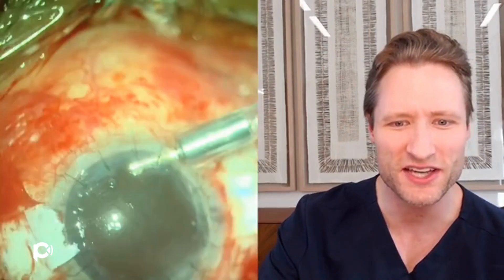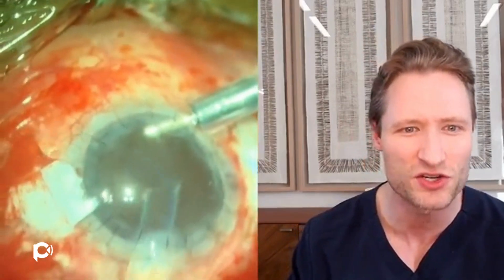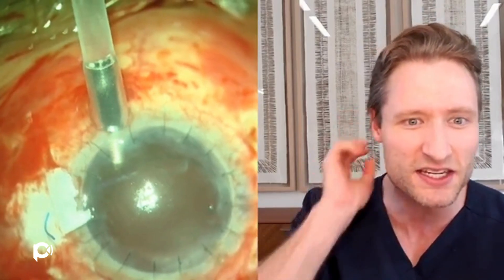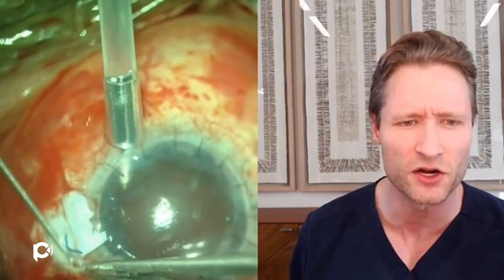Once the lens is out of the eye, we have an aphakic unicameral eye, and it's time to inject the new lens. This is another reason why the glued IOL is superior for this patient over the Yamane technique — if you were doing Yamane, you could not have held the patient's existing lens in the eye as we did here. The glued procedure was necessary to hold the lens stable. This is a CT Lucia, which I chose before starting the case because it's such a versatile lens and useful for everything.